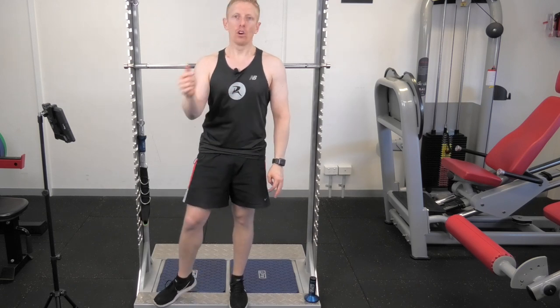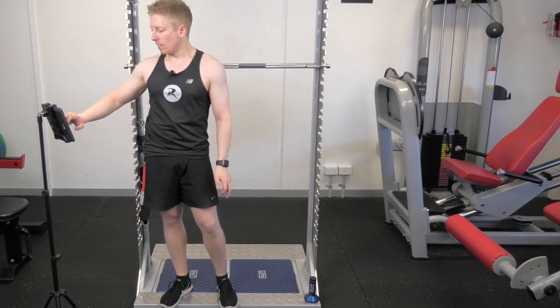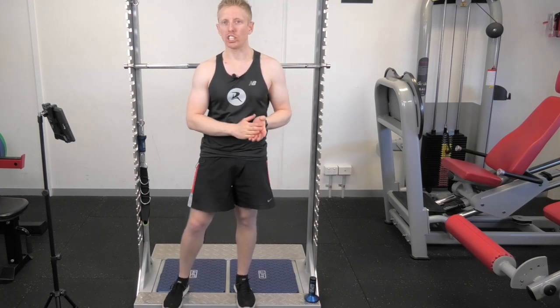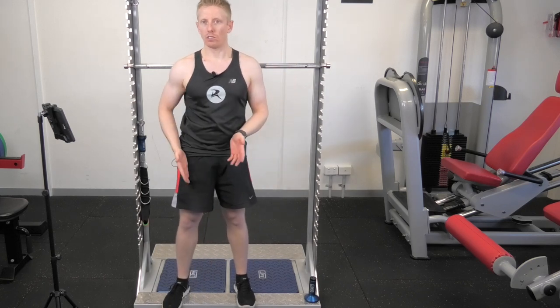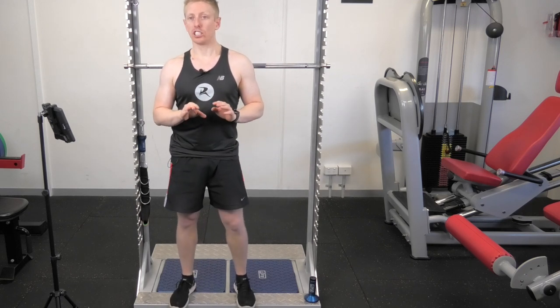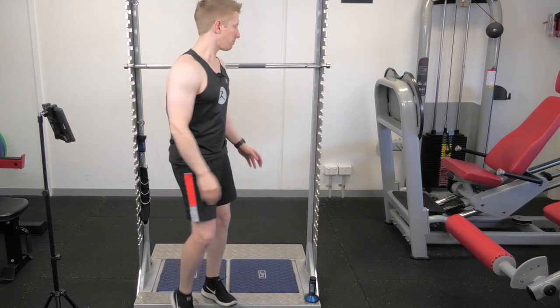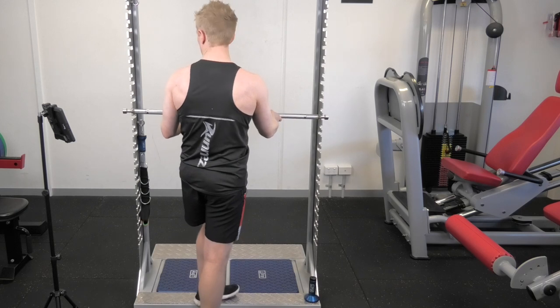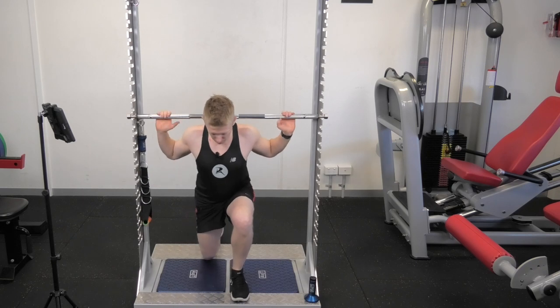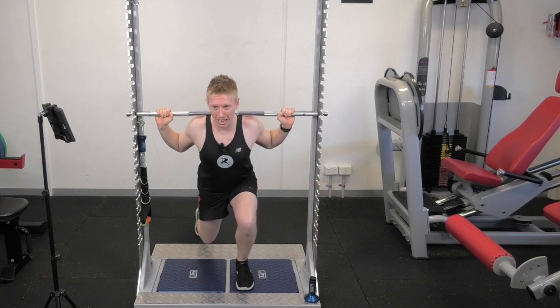So what do you think's going on there? Have a think — write in the comments below or head to our website and join in the chat. When I look at rate of force development again, I was about 8% quicker and more able to generate force on the left leg than the right leg. There are our squats — three different assessments done. We're going to do the same for the lunge now. While we've got the isometric bar here, we're going to start with that first.